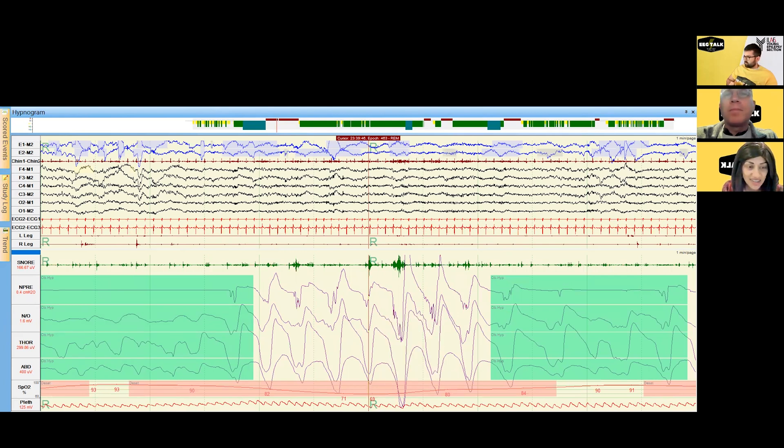The lowest oxygen saturation here is 69% — and you see a pretty quick resaturation. We do frequently see that patients with obstructive sleep apnea resaturate pretty quickly, but depending on severity, there can be what we call chronic intermittent hypoxemia, which is very problematic in terms of the cardiovascular and cerebrovascular sequelae that can come from untreated obstructive sleep apnea.